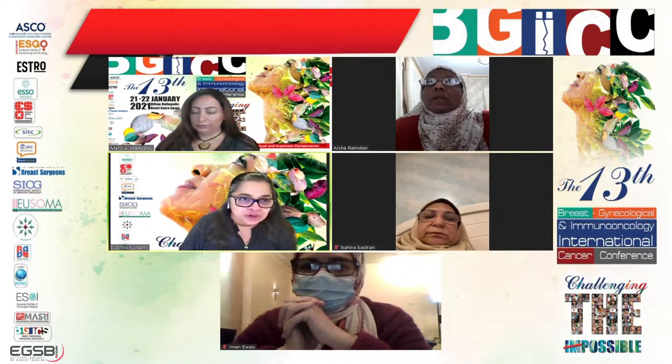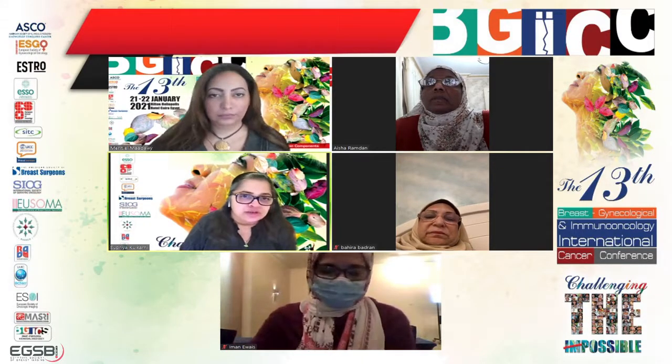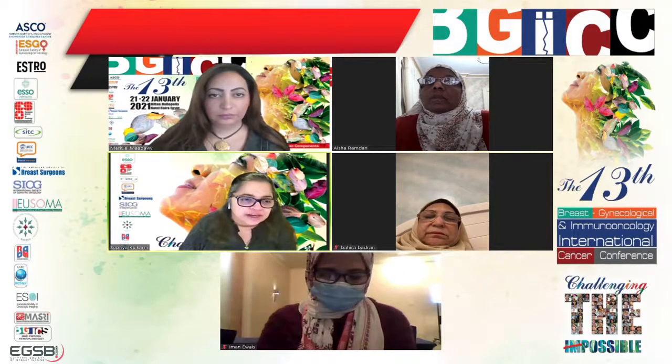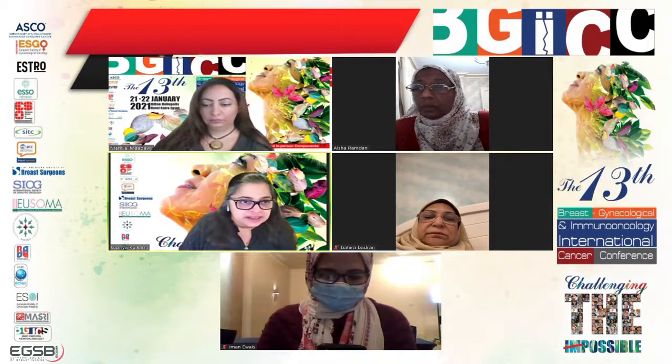You will get more workup, more MR biopsies. So if your facility is equipped to do all of that, for sure you can offer MRI to everybody that comes your way. We don't have that luxury, we are restricted in how many MRIs we can perform, but I personally do believe that it does help.